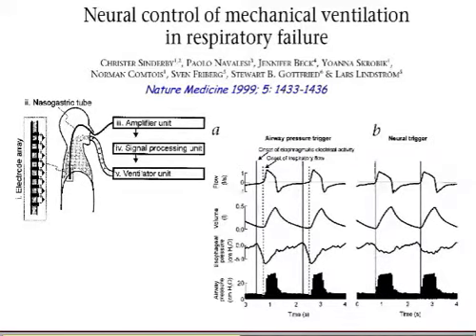And of course, it's been shown already that neurally adjusted ventilatory assist, due to the fact that it detects diaphragmatic EMG activity much more proximately than all our pressure and flow sensors, can decrease the trigger delay, as shown in this example from the initial study by Chris Sinderby. You can see here that the trigger delay in pressure support disappeared when neural trigger was applied, which is fairly to be expected, given that it detects the diaphragmatic activity almost instantaneously.